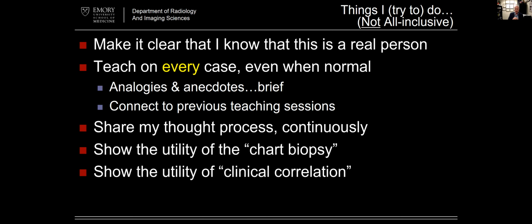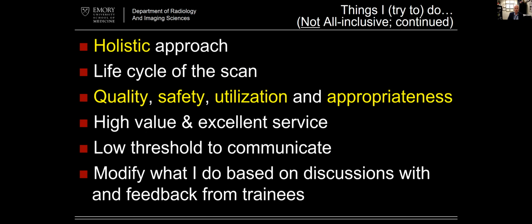And then of course there's the process of looking at the images, and then you figure out what you want to say about it, but then it's putting it into the clinical context. And of course that's the clinical correlation part, that we're not supposed to say anymore, that expression. But still the process, I think, is helpful to figure out how it fits in. And I keep telling them I'm focused on answering the question and finding the important findings and putting that into a clinical context of what would be hopefully helpful to that team helping take care of that patient.